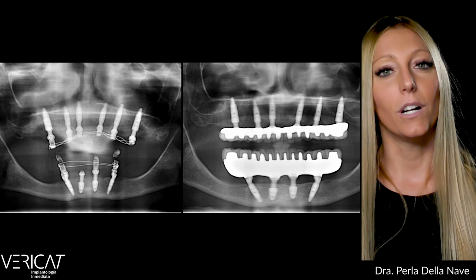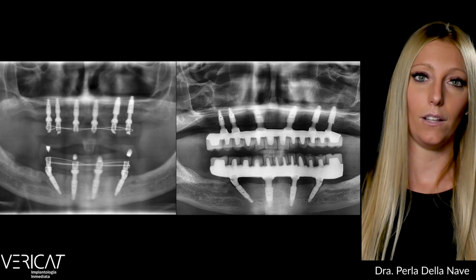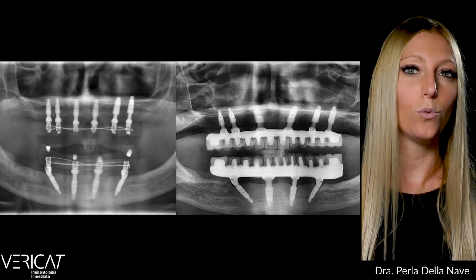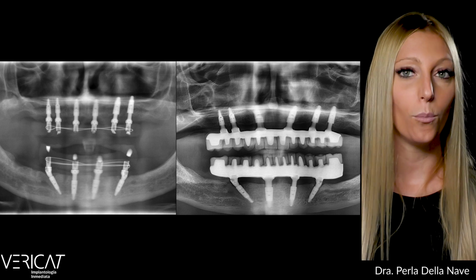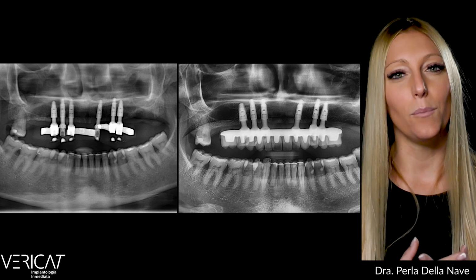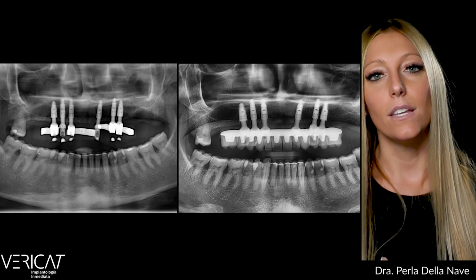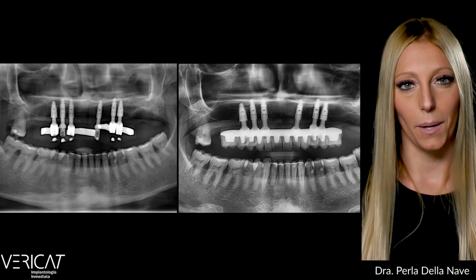The same marginal bone above the implant shoulder, or at most at the same level as, for example, in the 2 anterior superior implants which were placed at somewhat lesser depth the day of the surgery for bone density reasons. Last example, where we observe once again a totally predictable remodeling and 6 implants that after 3 years remain several millimeters in a subcrestal positioning.